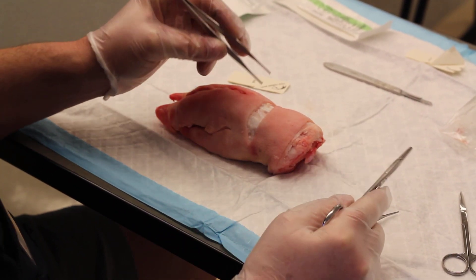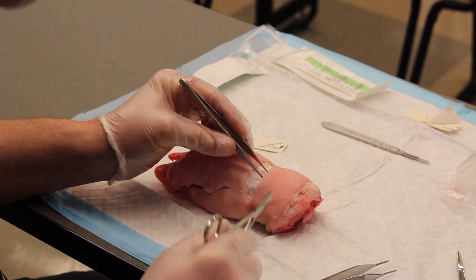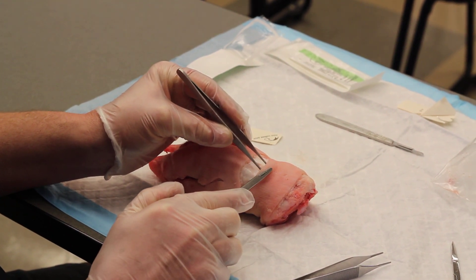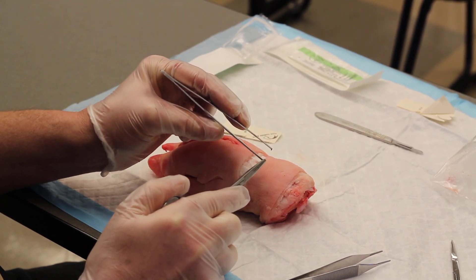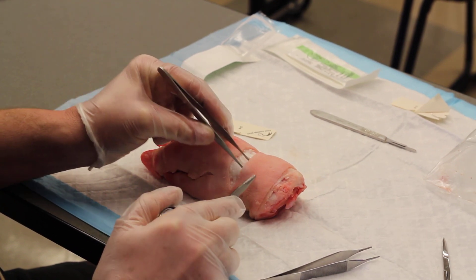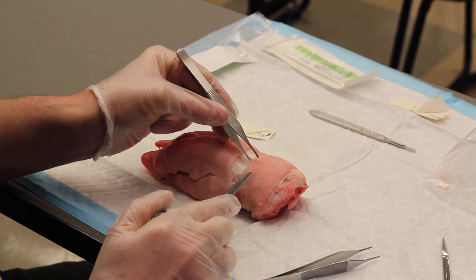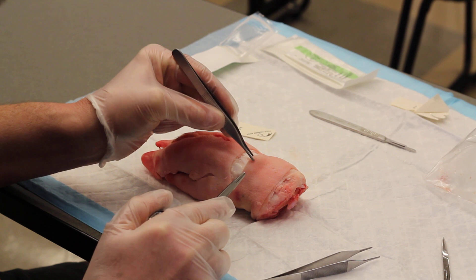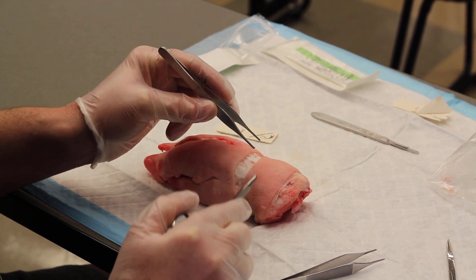Another thing you can do with the Adson forceps when suturing — a couple tricks of the trade — you can actually put the Adson forceps inside the wound and use it as a little bit of reverse traction to get your needle through the skin. Also, when using Adson forceps with teeth, instead of grabbing the tissue and manipulating it around, you can just use one jaw — that little hook — just to lift up the tissue and manipulate it without grabbing onto it, because grabbing more aggressively is the best way to macerate the tissue.